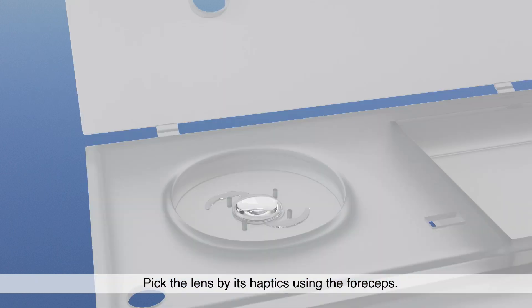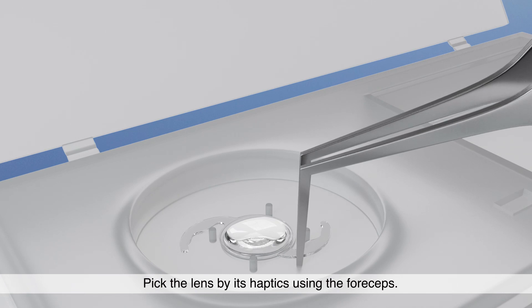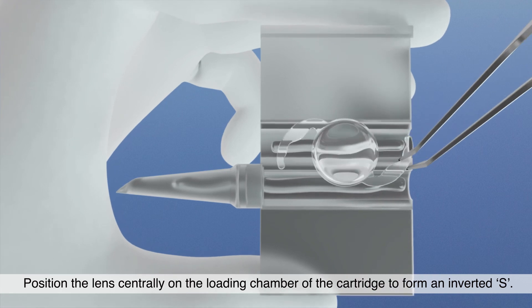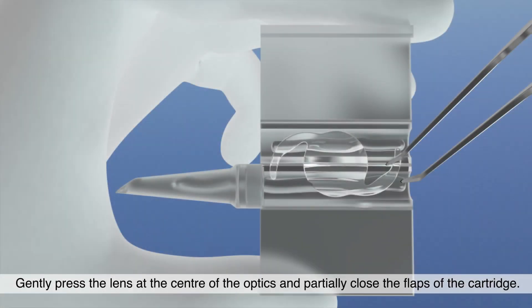Pick the lens by its haptics using the forceps. Position the lens centrally on the loading chamber of the cartridge to form an inverted S. Gently press the lens at the center of the optics and partially close the flaps of the cartridge.